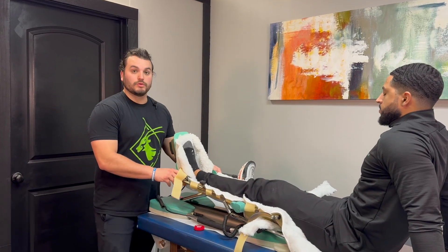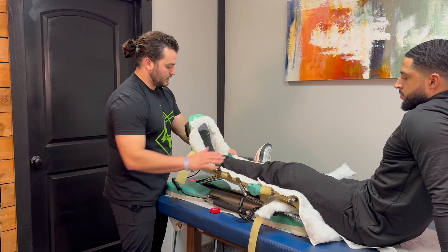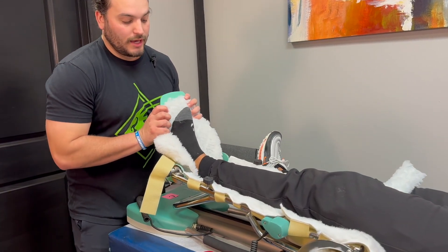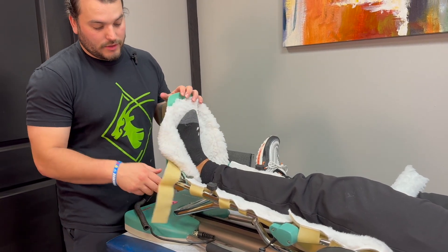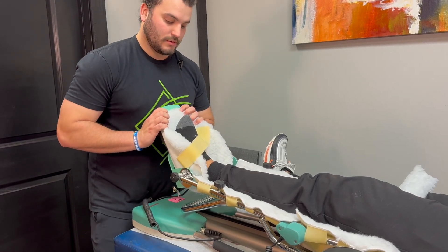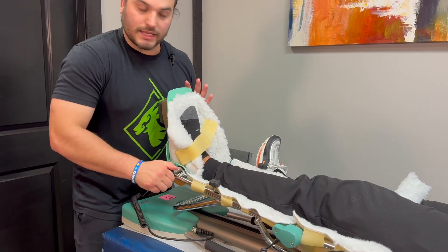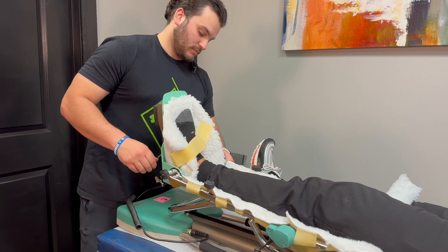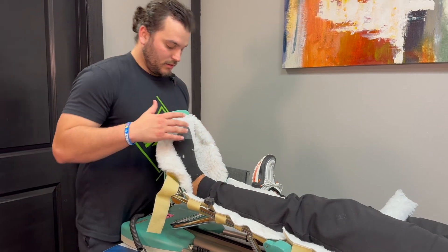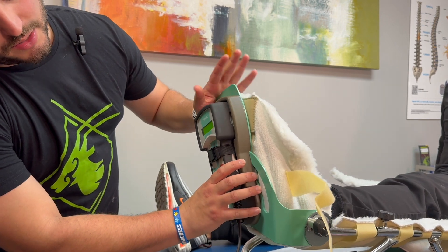For some patients we may have to make additional adjustments beyond just the lengthening of the CPM to get the knee positioned correctly. Some patients may have dorsal flexion issues where they can't fully have their foot all the way straight. You can adjust this with these two knobs to get as much comfort as possible for the patient. Also, if the patient's foot is contorting in or contorting out, there is a knob over here that you can adjust to accommodate how the patient's foot will be.